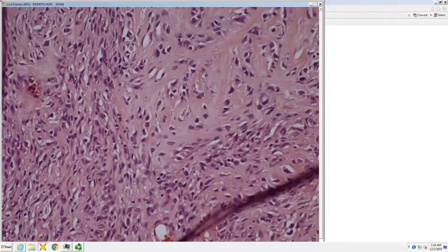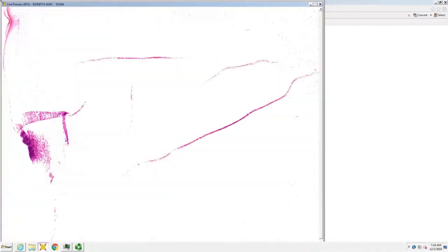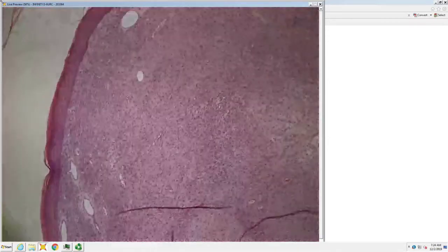Okay. So epithelioid histiocytoma is a factor 13A positive dendritic cell that tends to be pyramid shaped, triangular with elongated processes, but it shares with dermatofibroma the overlying acanthosis. So epithelioid histiocytoma.